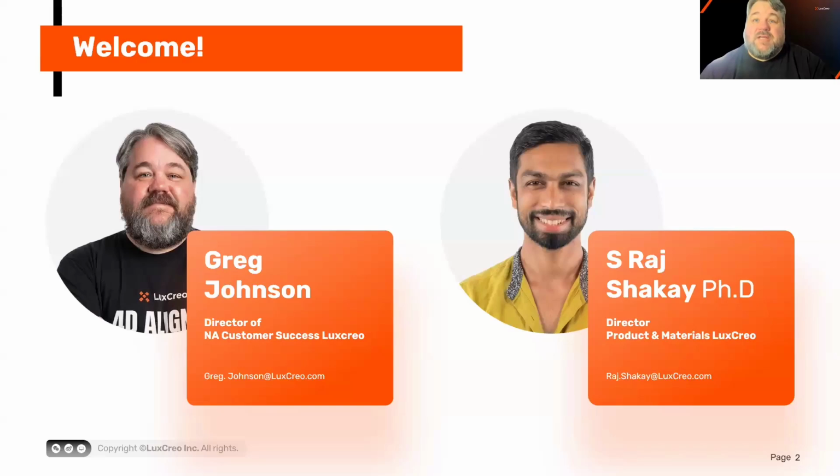Our assumption, though, is that you already have a basic familiarity with LuxDesign and you're ready to go to the next level. This presentation should unlock your creative potential by providing you some of the tools that you need to take your treatments to the next level.